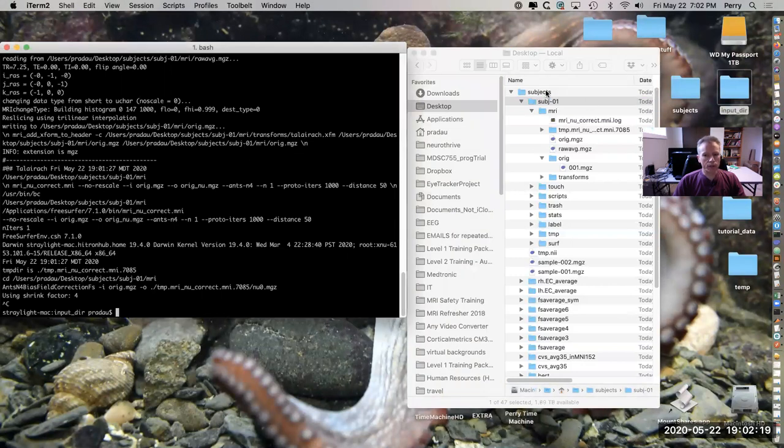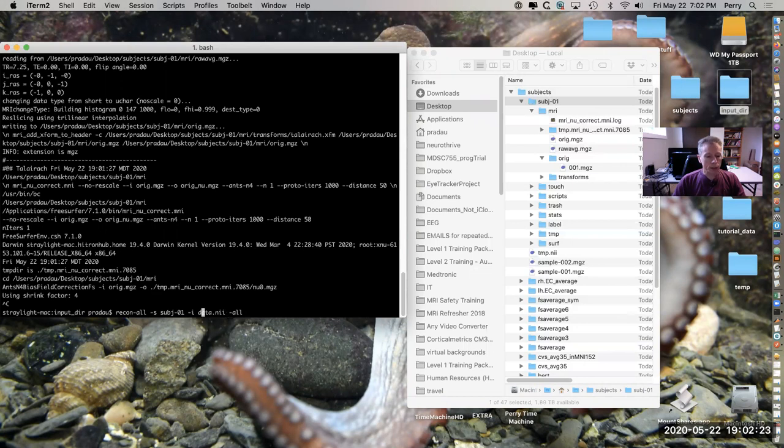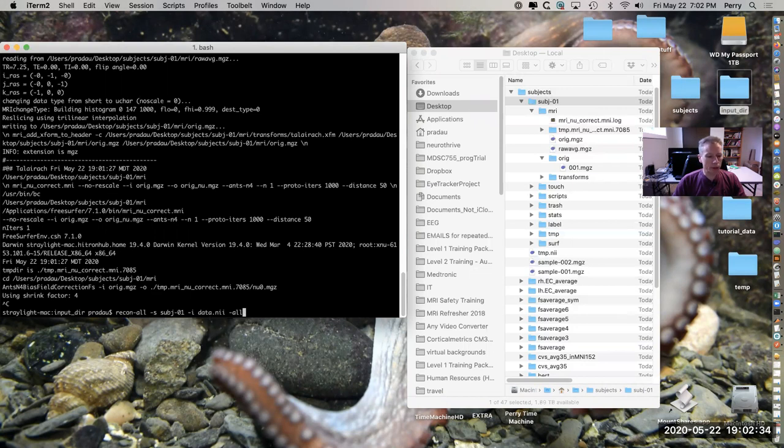Notice also that I didn't specify the full path name. If we look at that command again, I only specified the ID. If you do want to specify a different subjects directory than the one that's in the environment variable, you can do that.